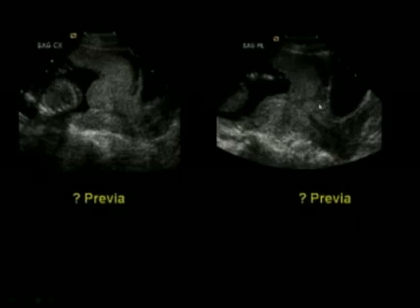And when you're dealing with uterine contractions, you can't tell whether there's a previa. Everything is distorted. So what do you have to do? Well, don't even try to determine whether there's a previa on these pictures. Don't spend any time. You just can't tell. What you have to do when this happens is wait a few minutes for the contraction to go away, and then when the contraction goes away, you'll be able to tell whether it's a previa or not.